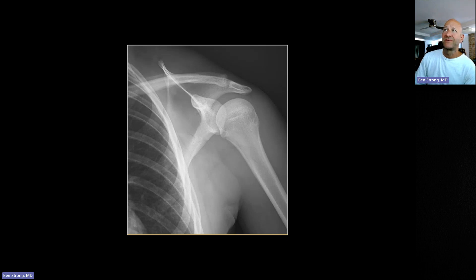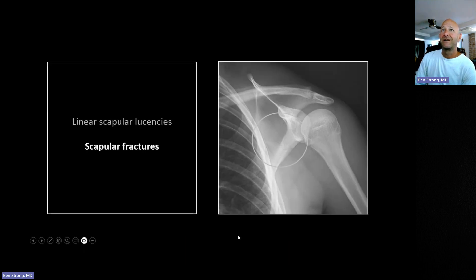Scapular fractures can be really, really subtle. When you see a lucency like this, it doesn't necessarily run out to a cortical surface where you can see a nice break in the thin pencil line that should always be the cortex of a bone. So these can be particularly tough.